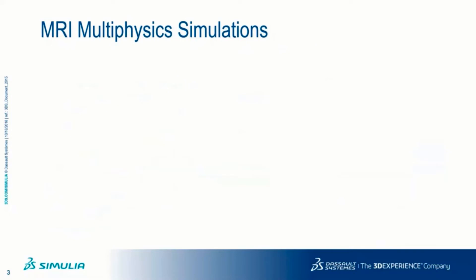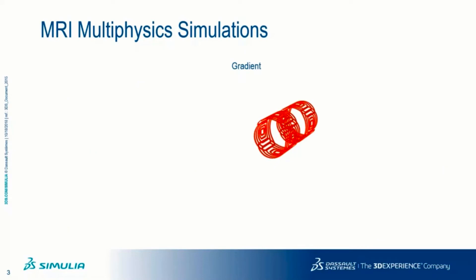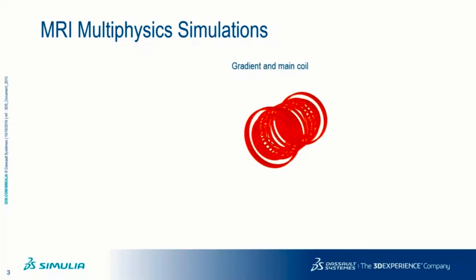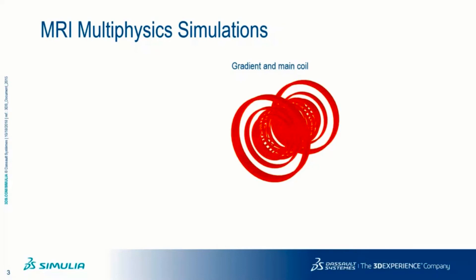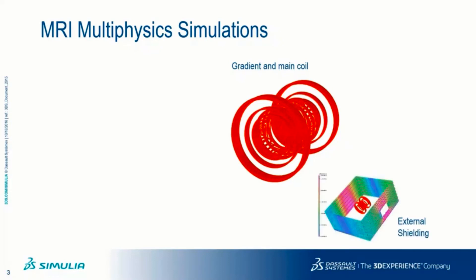So why are we calling this a multiphysics simulation e-seminar? We have gradient coils available for the x, y, and z directions. Around the gradient system we have the main coil creating the strong static field, and an active shielding coil to avoid too-strong magnetic fields outside of our MR system. Even with active shielding, we may also have some external passive shielding in the treatment room.